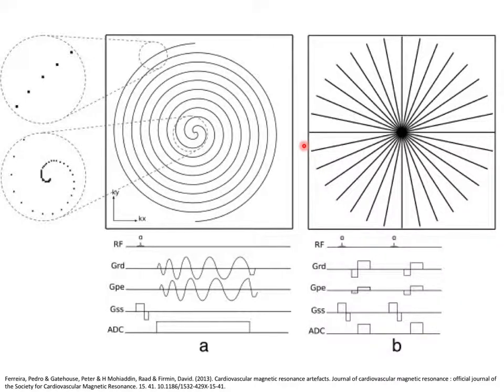Some other interesting patterns of sampling are the application of continuously changing gradients while you are reading out your sample. So if we select a slice, and we have now a 2D sample, and we pulse the gradients with a sinusoidally oscillating amplitude, and on the readout and phase encoding direction we slightly phase shift them, you will essentially be sampling K-space in a spiral like this, right?